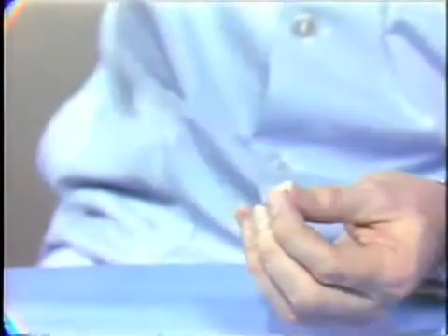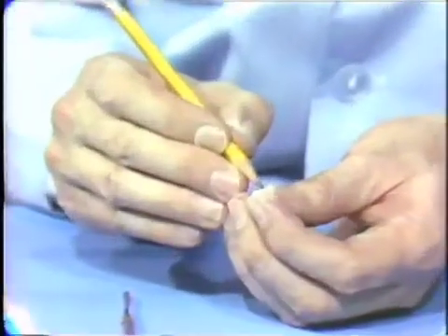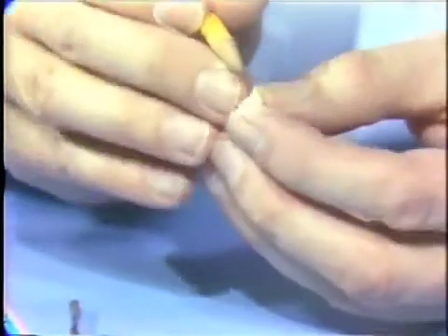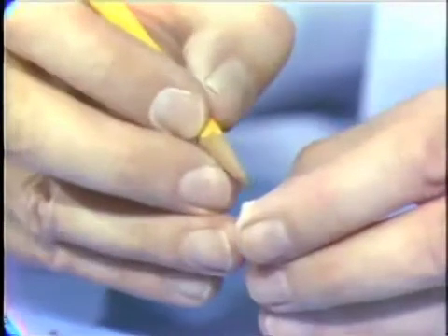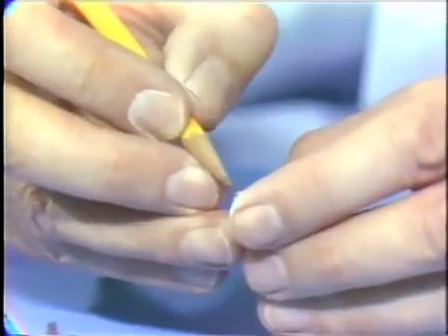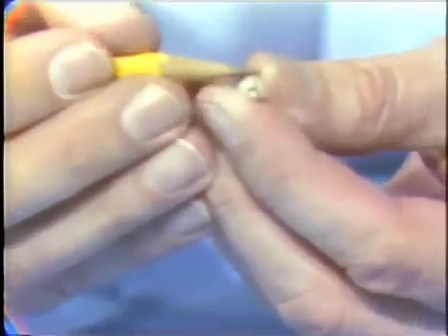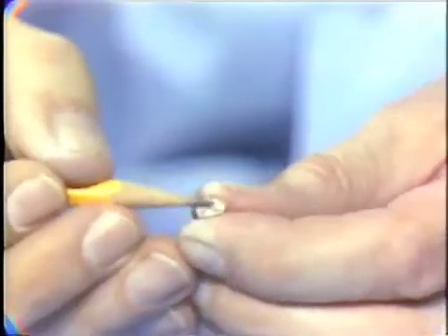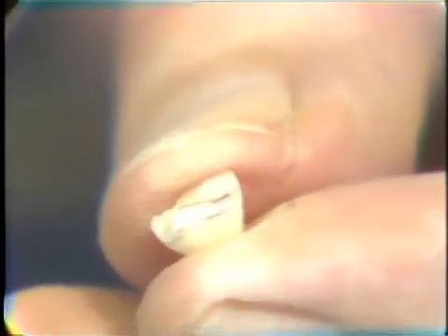Now I'll take a pencil and see if I can mark this so that it shows up the extent of that bevel. I'm just running the pencil along here so that it is automatically picking up the boundaries. Now, I think perhaps you can see that in a close-up. I'll try and hold it as still as I possibly can.